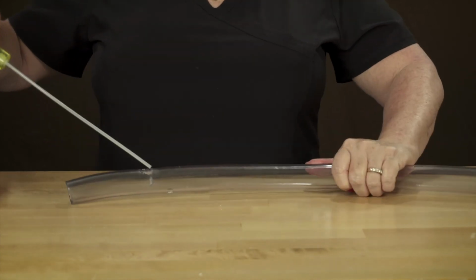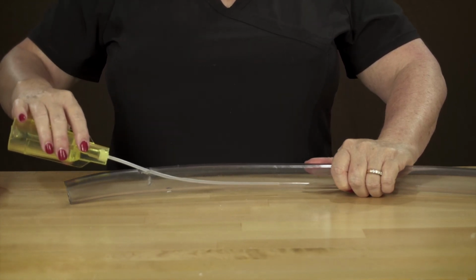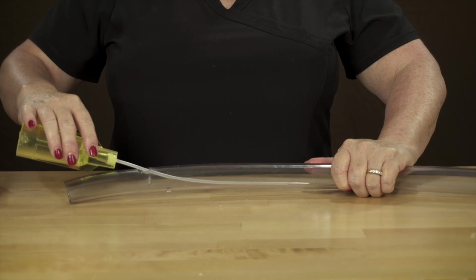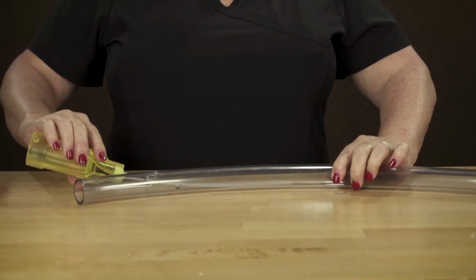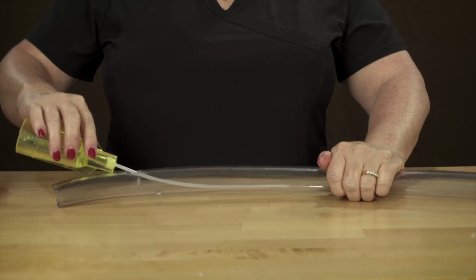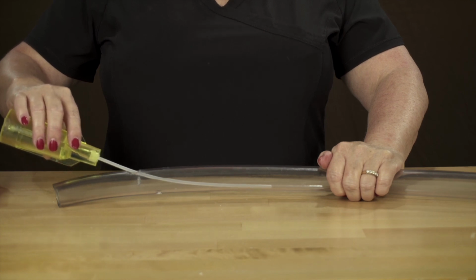Insert a smaller cannula with greater than 50 to 60% vein purchase to demonstrate how a lower angle of insertion allows for less mechanical irritation, can allow for greater vein purchase, and can potentially reduce wall shear stress by allowing the delivery of infusates parallel to blood flow within the lumen.